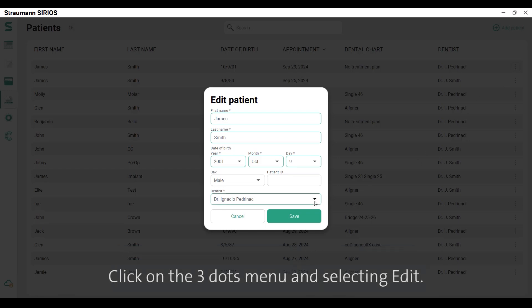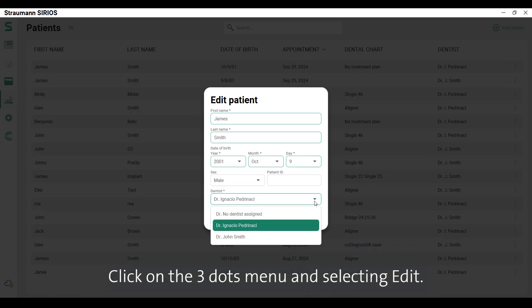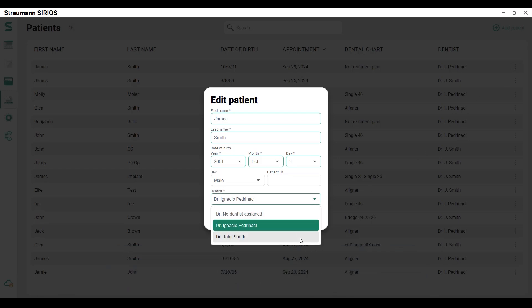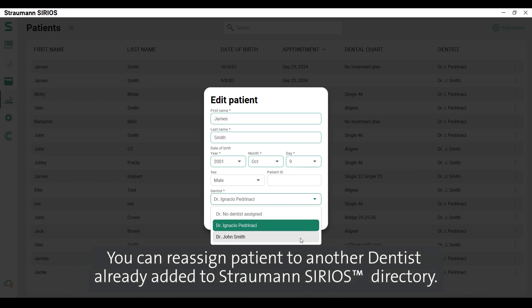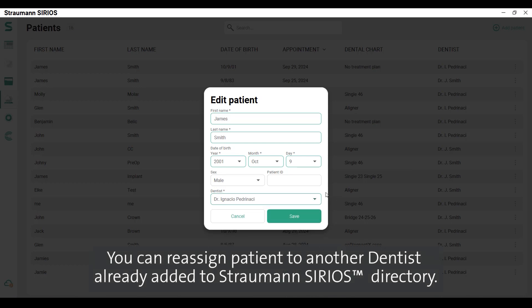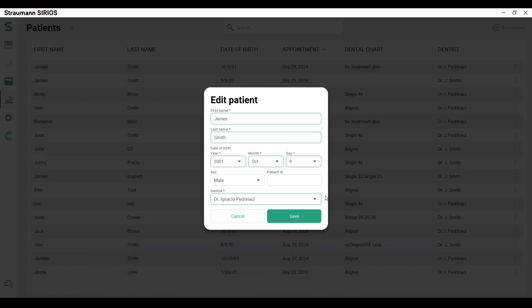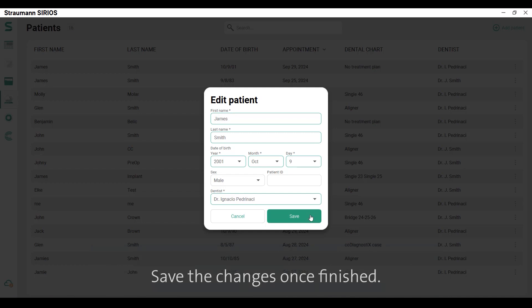Click on the three dots menu and select edit. You can reassign a patient to another dentist already added to the Straumann SIRIOS directory. Save the changes once finished.